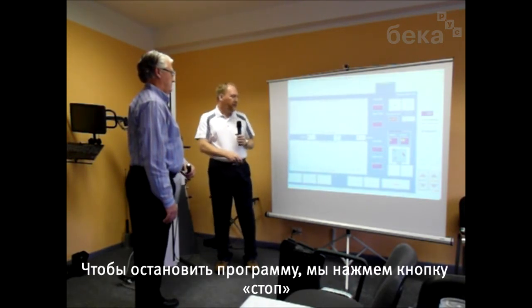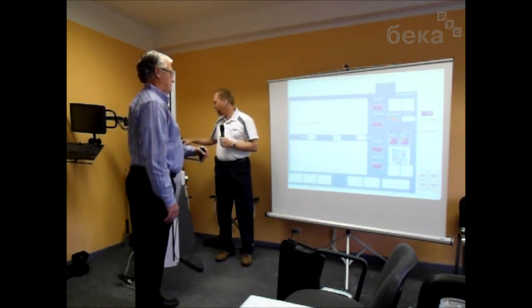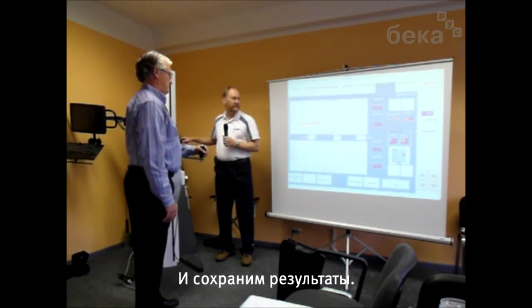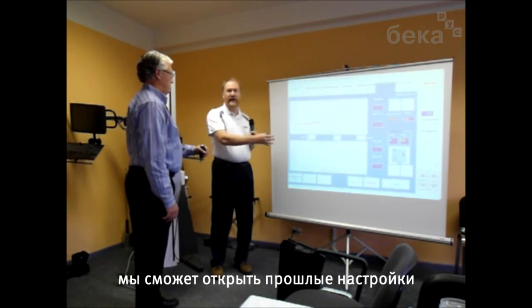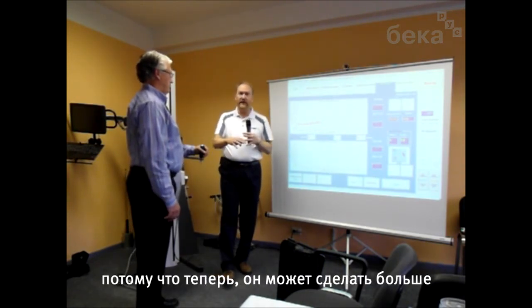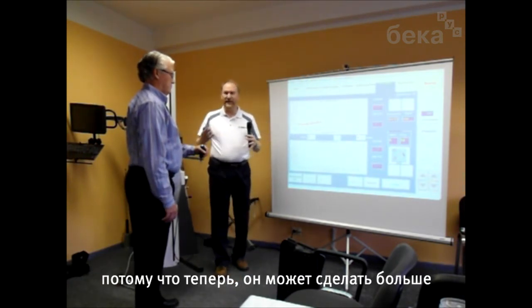So at the end, again, we can just press the stop button to end the exercise. And then save the results so that we have the information stored, and then the next time the person comes in, you'll be able to replicate the setup. You will have to set a new range of motion when they come back for the next day, because hopefully it's improved, and you won't want to use the old range of motion because it's better now.